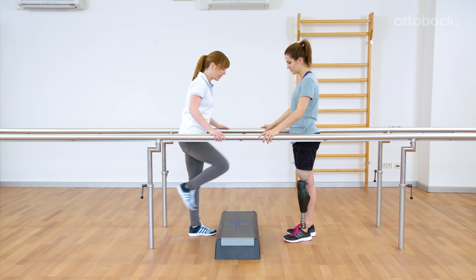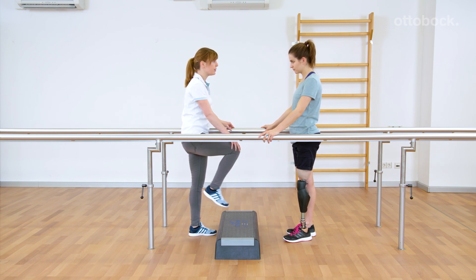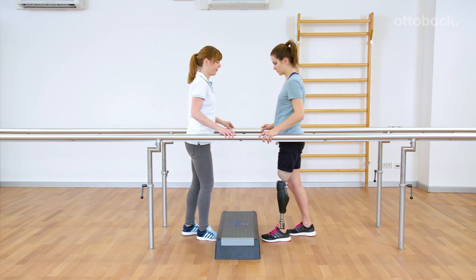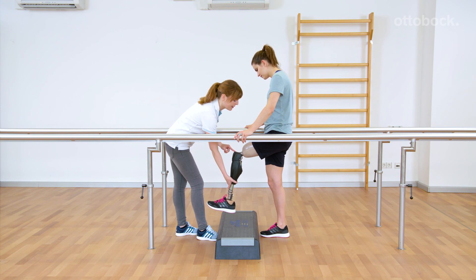As long as the prosthesis is loaded, the knee remains blocked against flexion. If the prosthesis is not loaded after triggering the stairs function, the knee joint will not block against flexion.